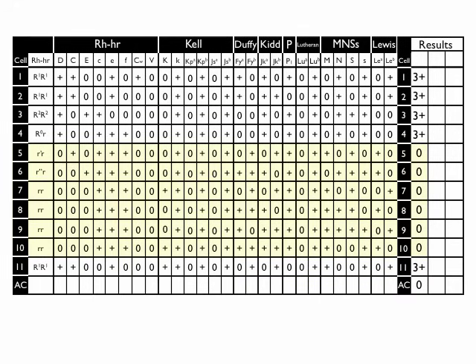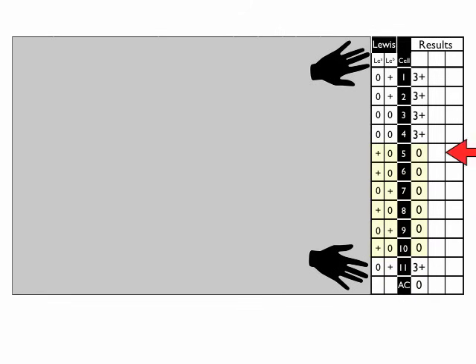I will tell you, I personally do these with a slightly different approach. Rather than doing things horizontally, I look at things vertically. I look at things blood group by blood group. So in other words, my piece of paper or my straight edge or ruler comes from the side, and I look at things again blood group by blood group. There's a couple of ways that you can do this. Let me show you the way that I typically do it.